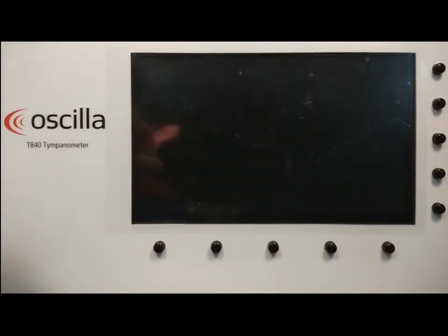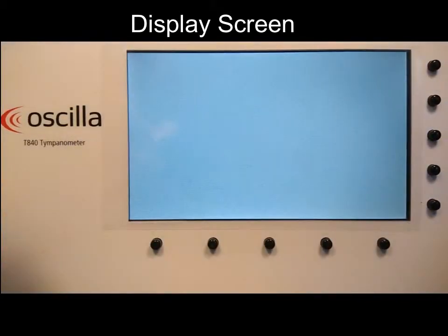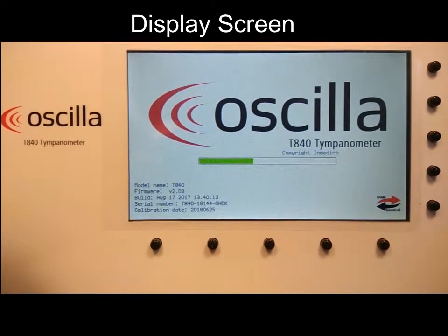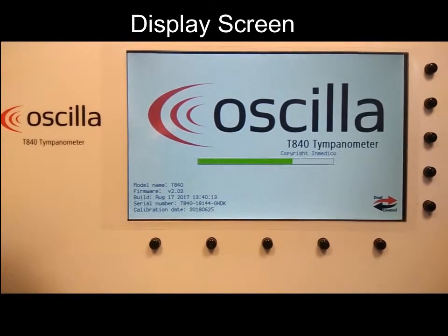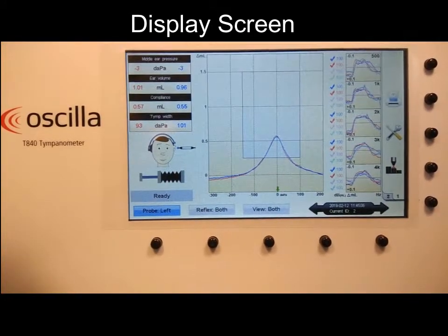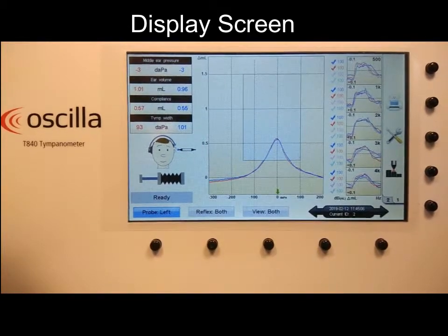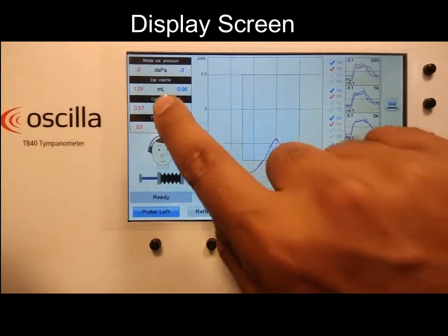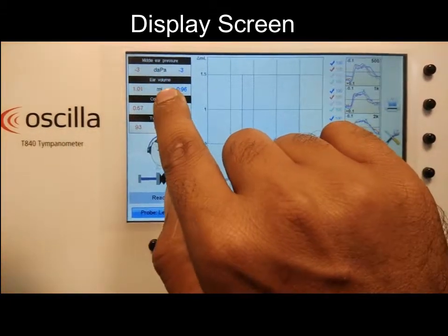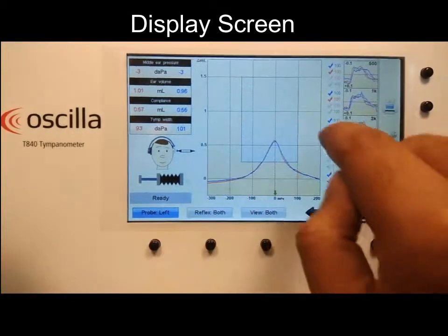Let's turn on the tympanometer. This is the main screen and the test engine is being loaded — just wait a few seconds. Here we go. This is the main screen you will get once the tympanometer is on. Here you can see the online values of middle ear pressure, ear volume, compliance, and tympanogram width.